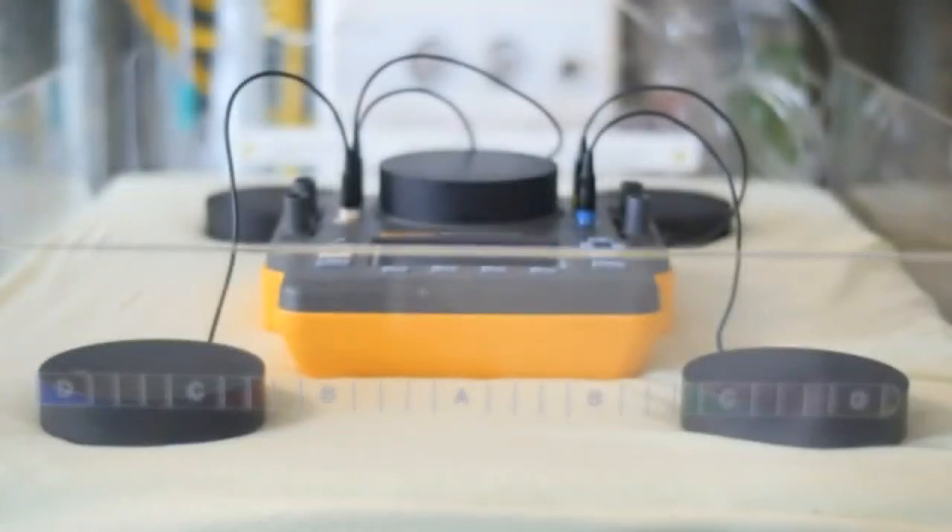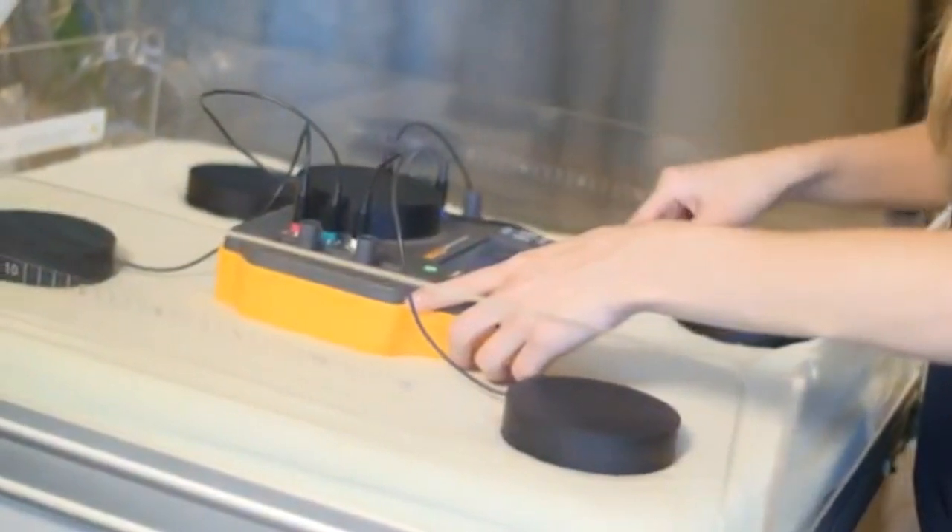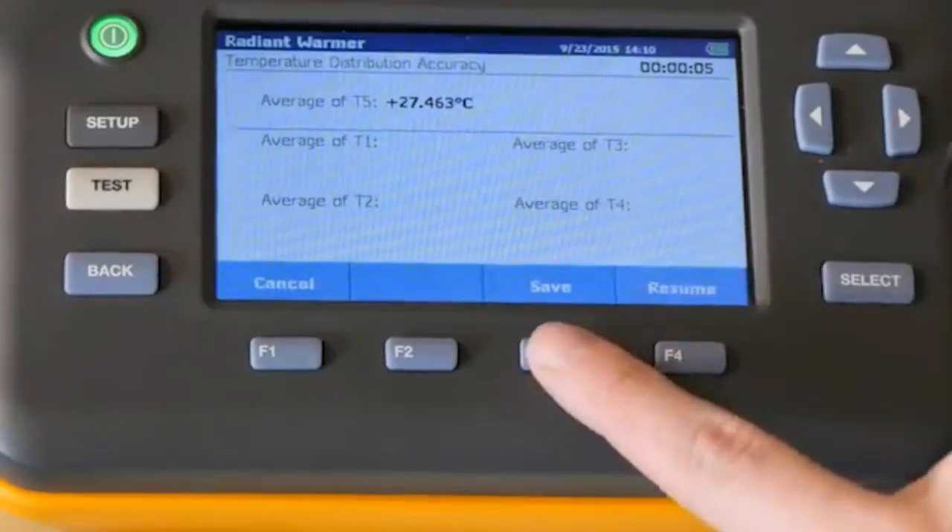Once an incubator reaches a steady temperature, it takes just 15 minutes to conduct a sequence of tests, which can be customized and stored in the analyzer.